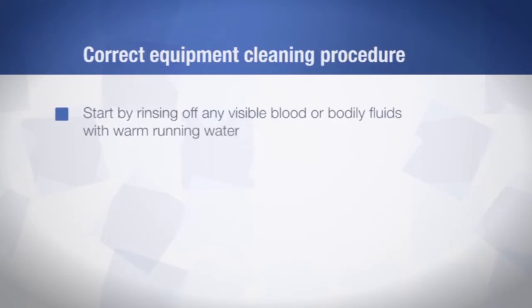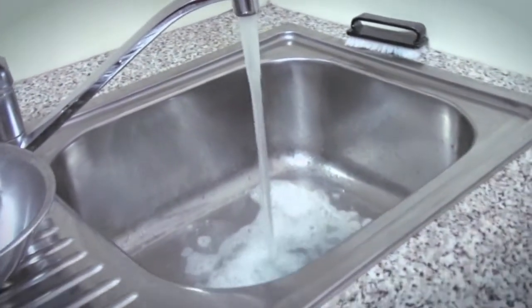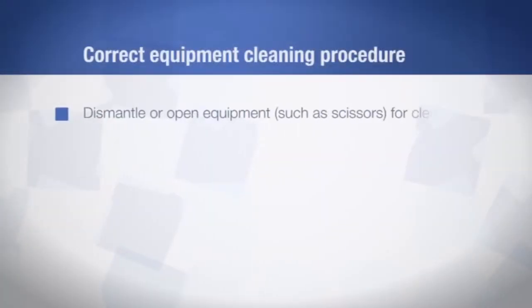Start by rinsing off any visible blood and body fluids with warm running water. Fill the sink with warm water and detergent — the detergent should be one that is approved by the equipment manufacturer. Dismantle, or in the case of equipment such as scissors, open all items for cleaning.